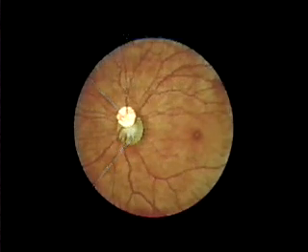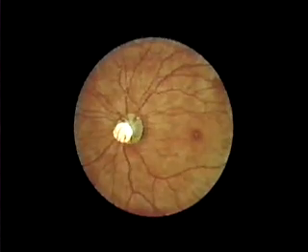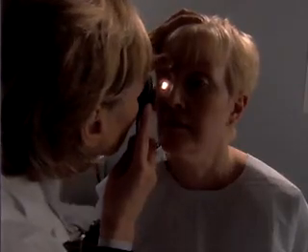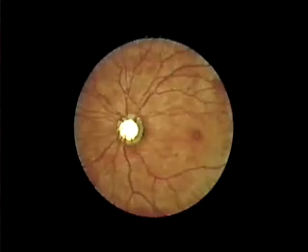Normally the disc is yellowish-orange to creamy pink and round or oval with well-demarcated margins. It may be surrounded by white or pigmented rings or crescents. The optic cup-to-disc ratio is usually less than 1 to 2. Adjusting the angle of your head and instrument and moving them as a unit, inspect the retinal vessels and adjacent retina by following the vessels from the disc to the periphery in 4 directions.